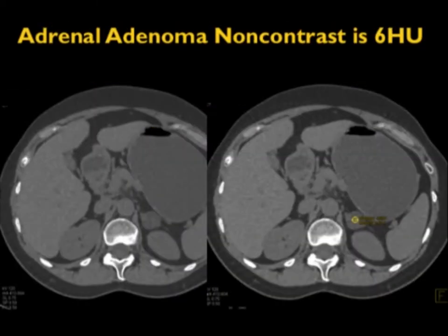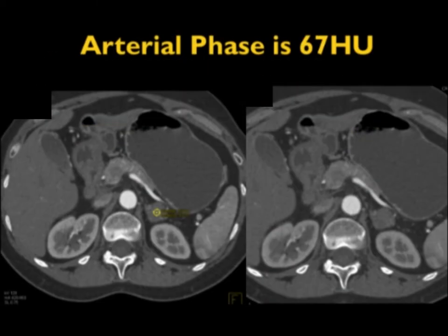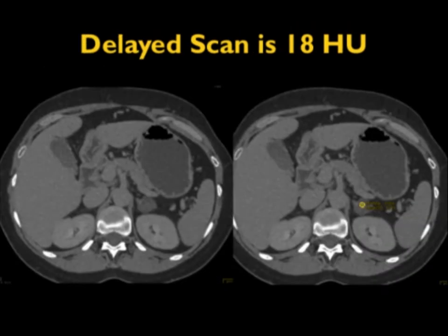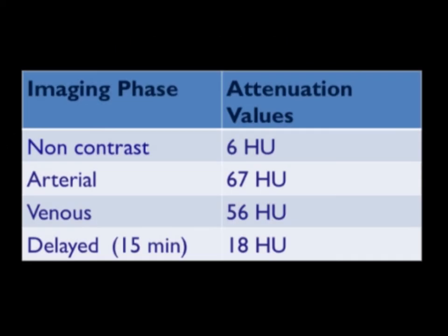Here's a left adrenal adenoma — six Hounsfield units, well-defined, water density. You do not need further studies; if you have that lesion, it's an adenoma. That same case went to 67 HU with arterial phase imaging, 56 HU venous, then washed out to 18 HU. You can see the spectrum: 6 to 67 to 56 to 18. From arterial to venous the washout is minimal, but going to the delayed scan, it washed out far more than 50%, making you very comfortable with an adenoma diagnosis.